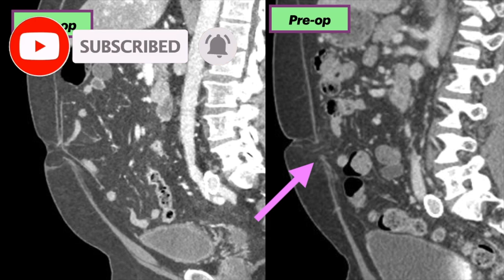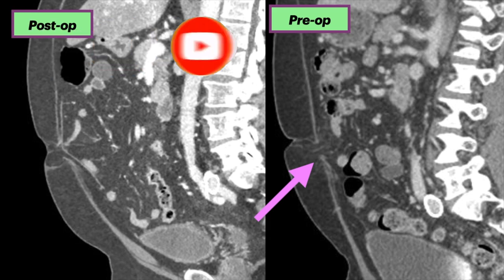Preoperatively, the patient had a three centimeter hernia causing increasing daily pain. Note the absence of the mesh repair on the preoperative image.